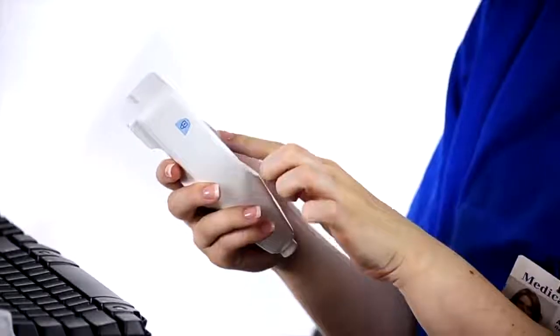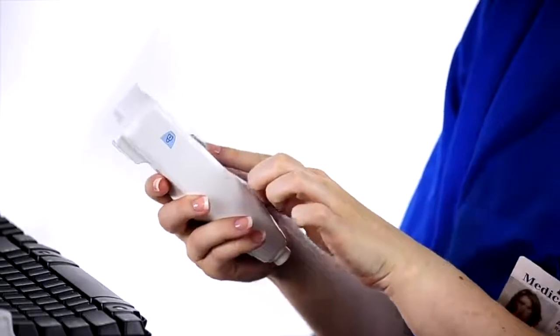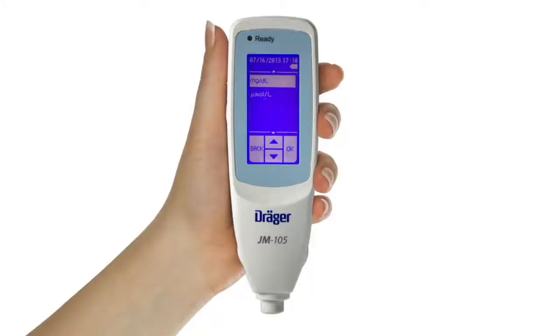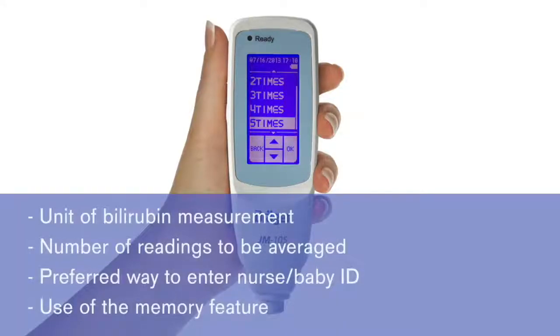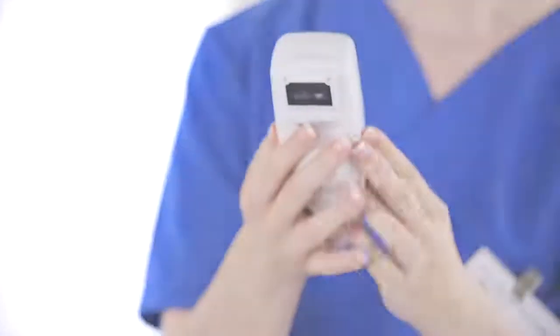Before using the JM105 in your clinic or hospital for the first time, you may wish to configure the device. In other words, change the default settings according to your needs. These options include preferred unit of bilirubin measurement, number of readings to be averaged, preferred way to enter nurse or baby ID, if these are required, and use of the memory feature. We will demonstrate how to set each of these features.